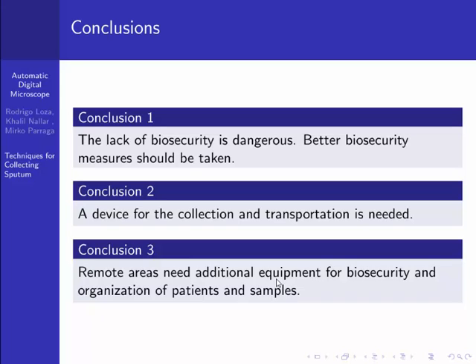Okay, so these are the three conclusions that we have reached in researching this stage of the diagnostic. The first one is that the lack of biosecurity is dangerous, therefore better security measures should be taken. And here I will introduce something that we call an embedded device to acquire and store biological samples. We have almost finished the device. We're releasing the log in a couple of days. What the device does is maintain a safe environment.